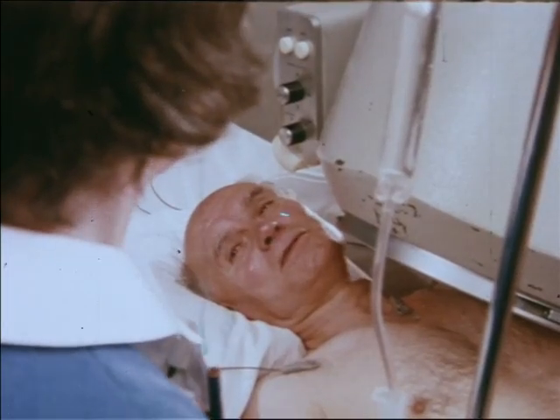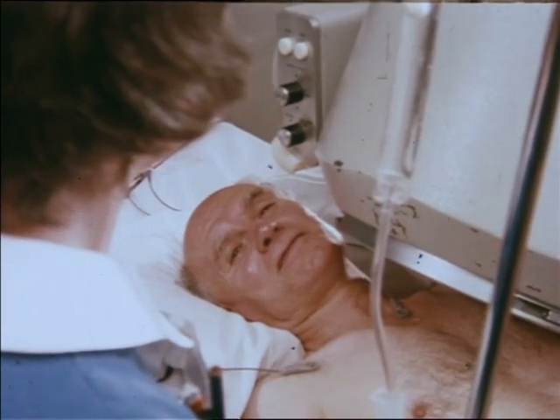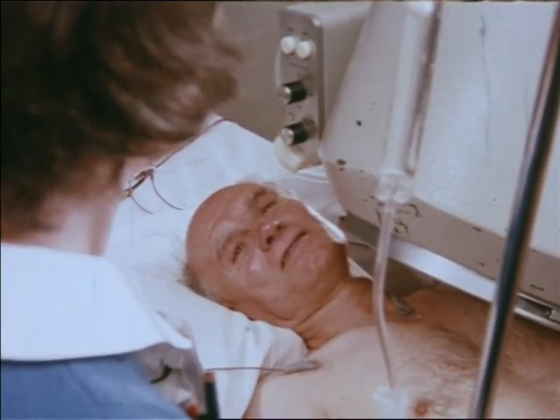But this man has a heart disorder. You'll have lots to tell them when you get back. Here's a normal heart. That yellow patch on the right contracts to almost nothing, showing that a good volume of blood is being pumped to the body. Here's the patient's heart again. It's not pumping nearly as well. But just how inefficient is it?